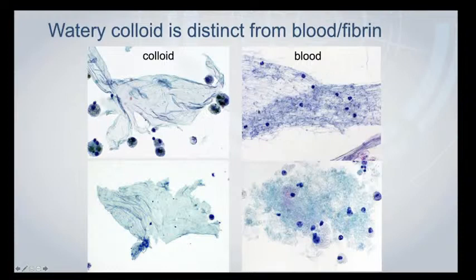A blood clot, shown here in the upper right, typically has a thread-like appearance, which is fibrin. The clot often also has scattered and trapped white blood cells like neutrophils, some lymphocytes, and even bare nuclei of thyroid follicular cells.